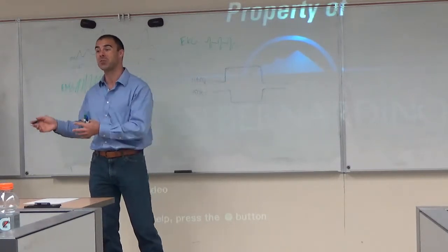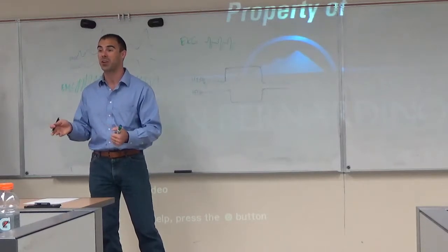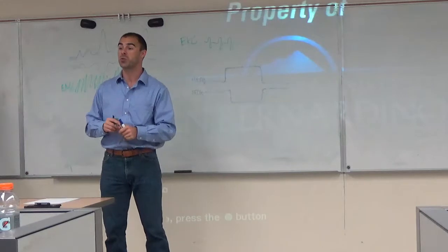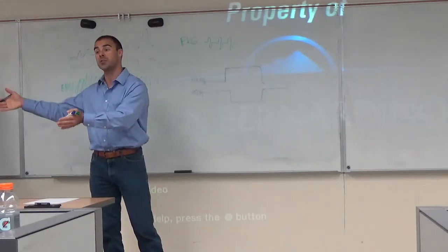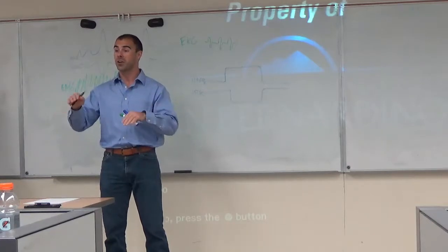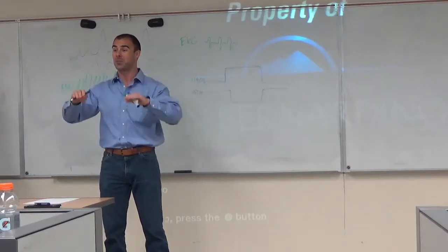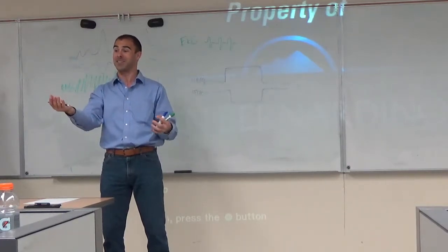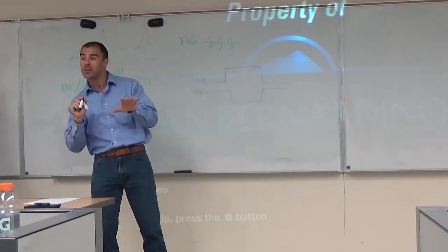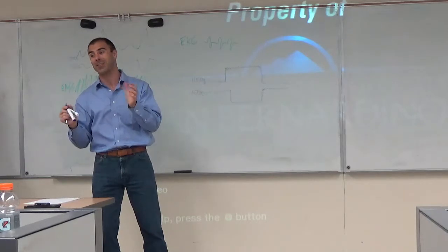Because you want to see how your manipulations in your experiment that are going to either raise or lower attention, or how your manipulations between groups of people who say have ADHD or don't have ADHD, are going to affect alpha, for example. So you definitely want to keep that in there. So it can be an artifact sometimes, but it kind of depends. Like a lot in life, right?